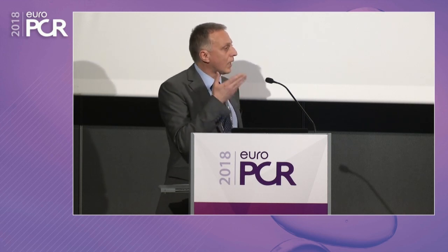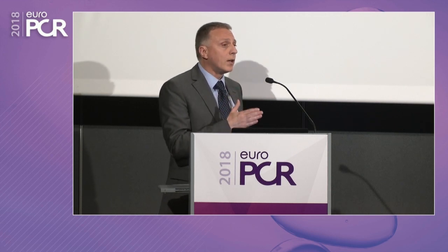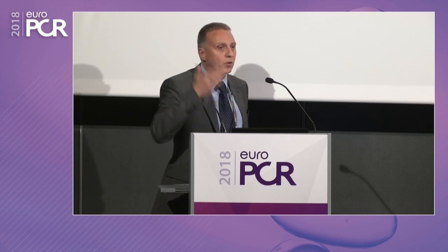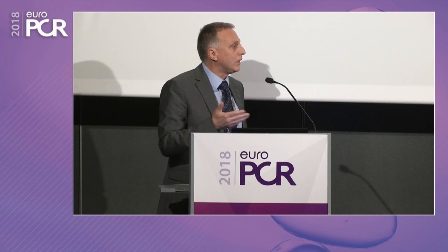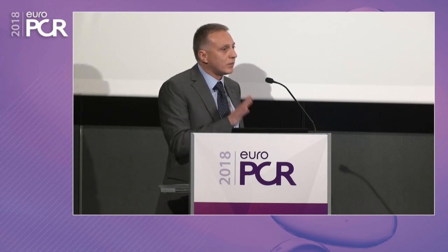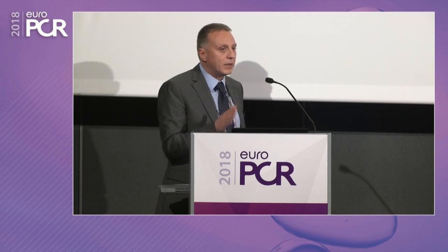So this is what I was anticipating. When you have this technique, you really have to be careful in all the stages. I don't think that all the procedures are done so carefully. Sometimes the patient complains of chest pain, and we have to make decisions on a fast track. And so I think that this is the main pitfall. Culotte is double provisional performed by an experienced operator in nasty cases.